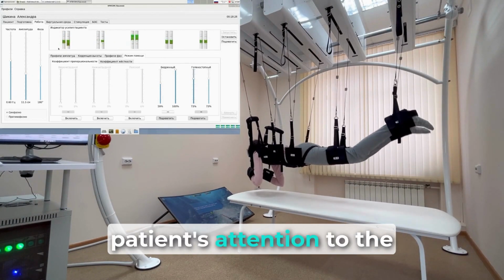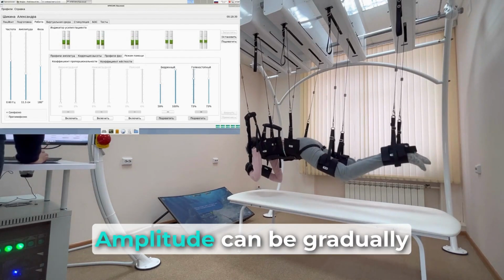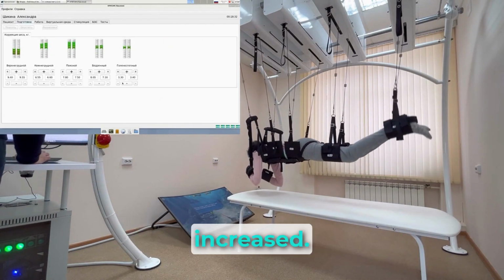It is necessary to draw the patient's attention to the rhythm of movement. It's very important to get into a rhythm. Amplitude can be gradually increased.